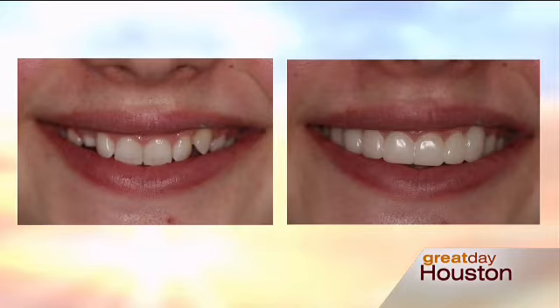It's very simple to eat with. Would you like to have a little something right here? Have a little breakfast right here. Let's go ahead and there you go. And hers was actually done in two sections because we wanted to keep her two front teeth her own because they were a little bit flared, and so to match, we built out the buccal corridor of her back teeth.